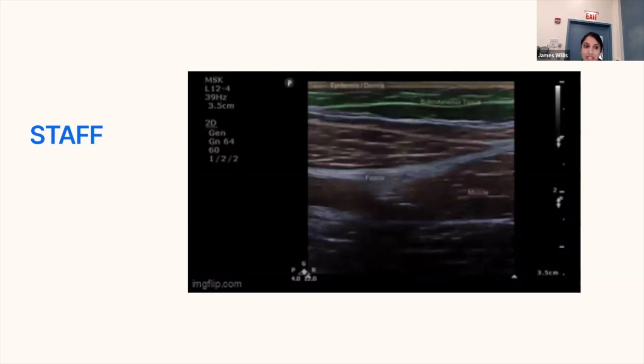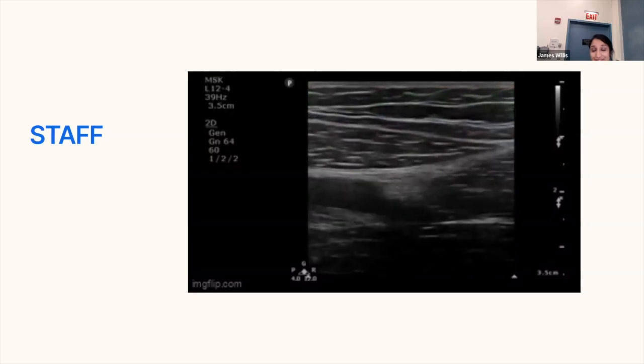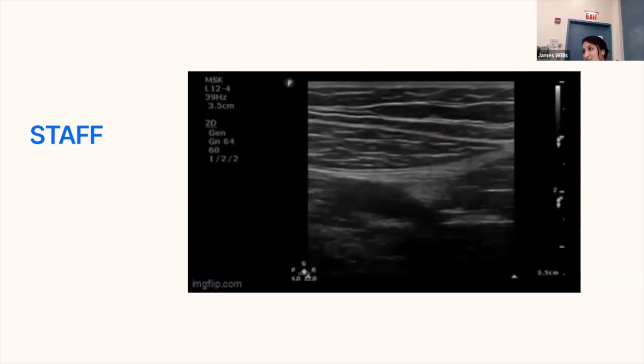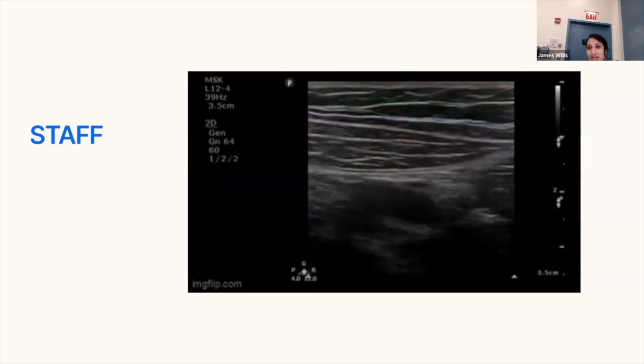They used the score we had spoken about, and they used ultrasound findings as well as physical exam. And in this institution, the patient was immediately taken to the OR, and they didn't do a CT or MRI. So they did a case study with this, and they decided that POCUS, if you use the acronym STAFF, subcutaneous thickening, air, and fascial fluid, is a good way of remembering what you have to look out for.